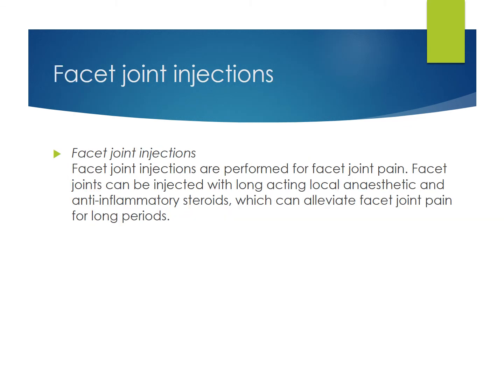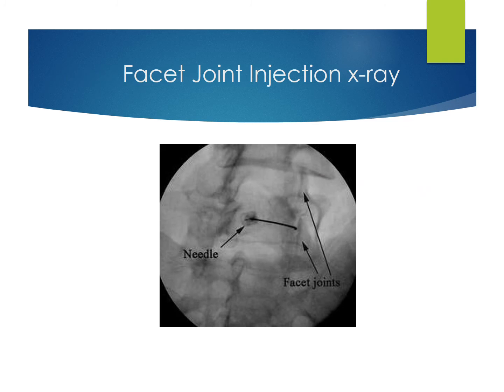Facet joint injections. Facet joint injections are performed for facet joint pain. Facet joints can be injected with a long-acting local anesthetic and anti-inflammatory steroids, which can alleviate facet joint pain for long periods. Facet joint injection X-ray.